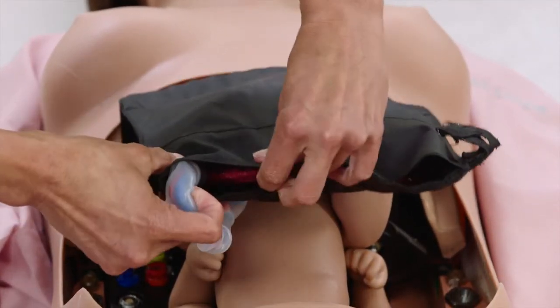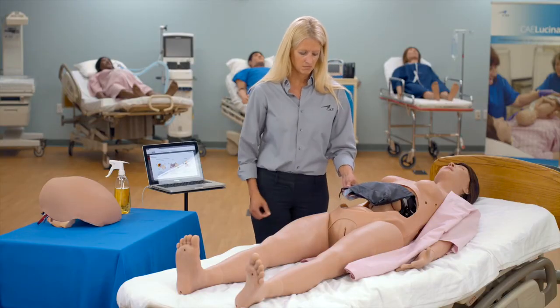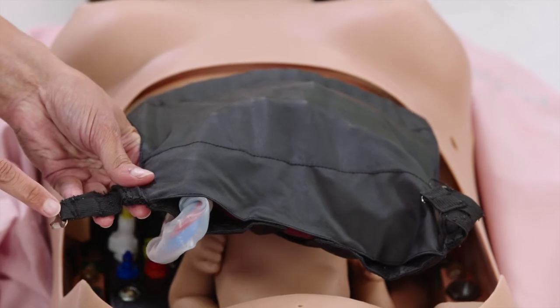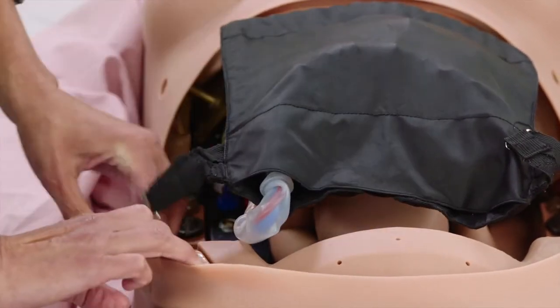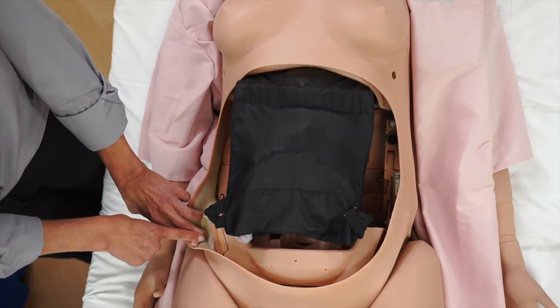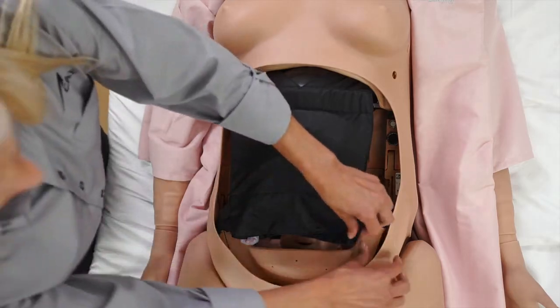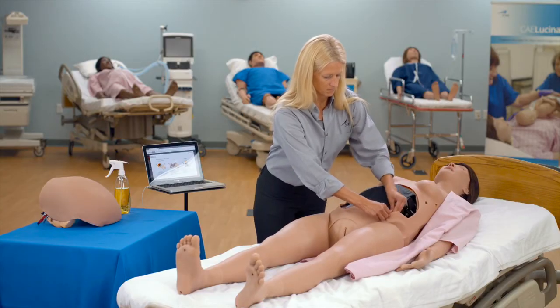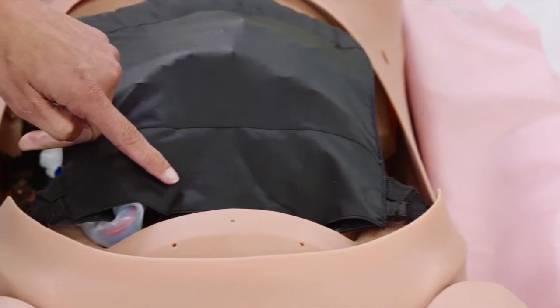Coil the remaining umbilical cord inside the placenta pouch, ensuring that the cord exits the placenta pouch on the same side that the fetus is facing. Cover the fetus with the placenta pouch. Attach the placenta pouch to the mannequin's pelvis by connecting the pouch straps to each side of the pelvis. Ensure that the front of the placenta pouch is tucked under the top part of the uterine funnel.